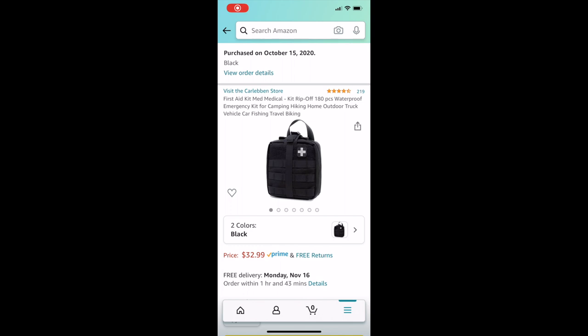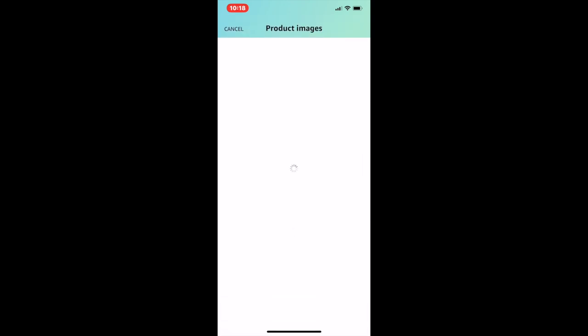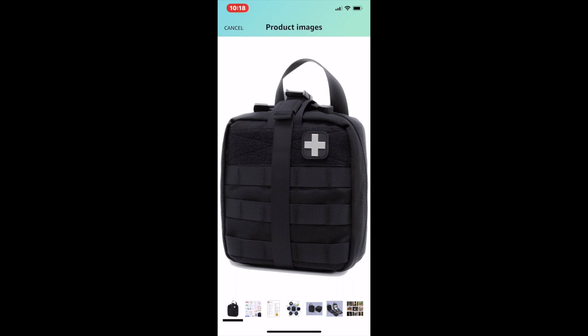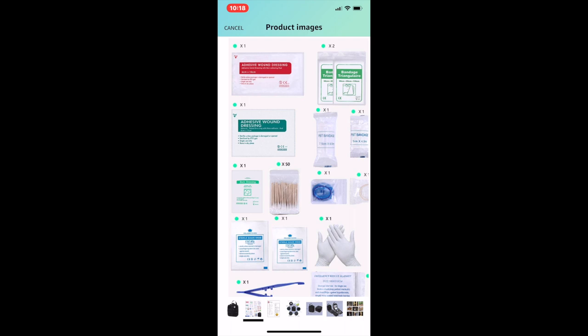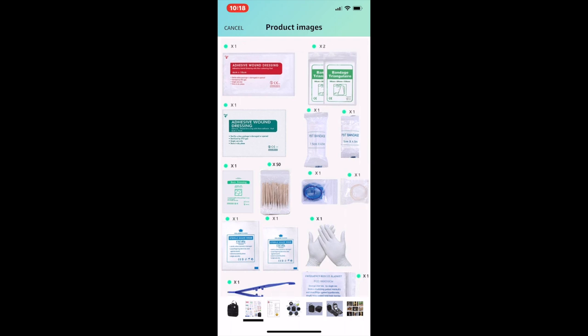Let's get into this medical kit review. As you can see, that is the bag. The price is $32.99 — prices are subject to change on Amazon. It has four and a half stars, which is not too bad at all. Those are some of the items inside the bag that I was showing you.